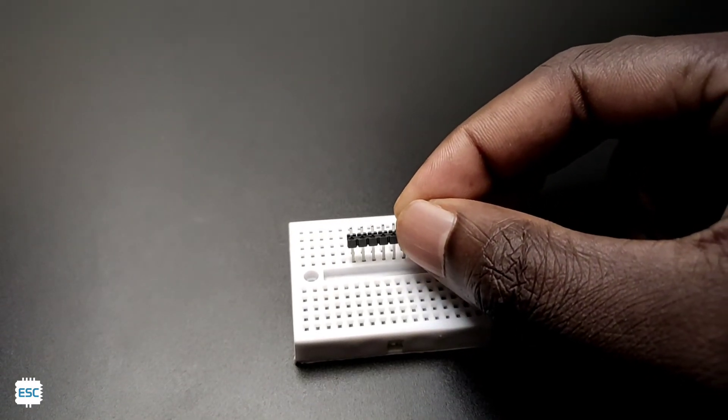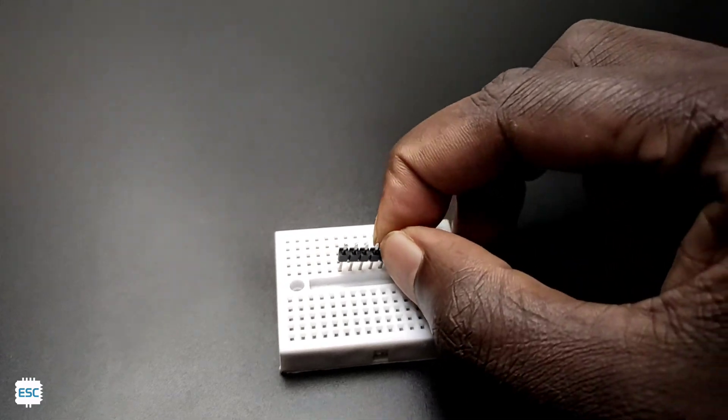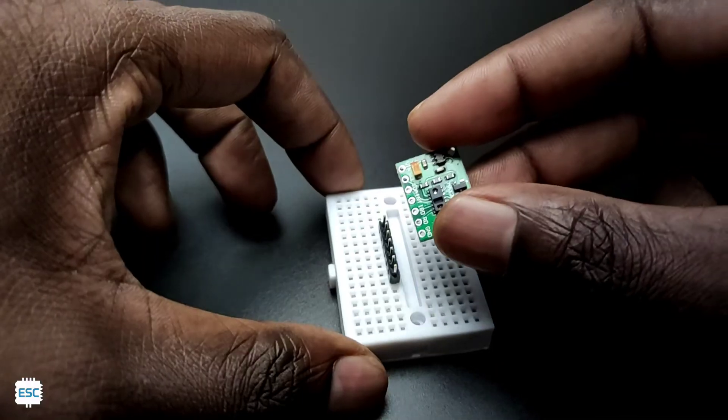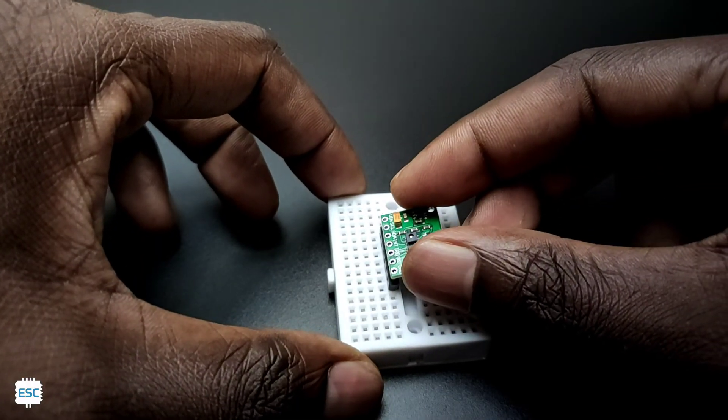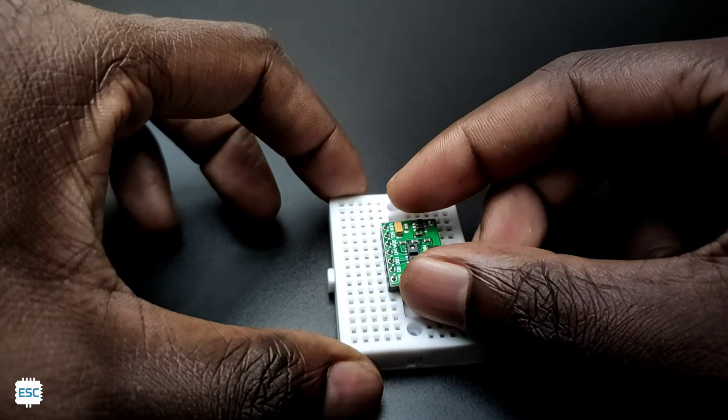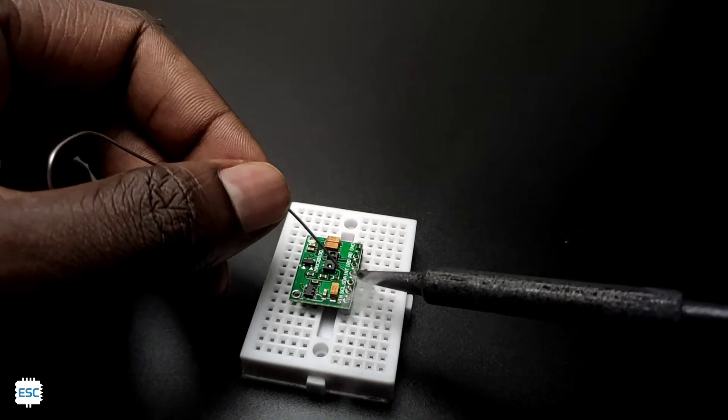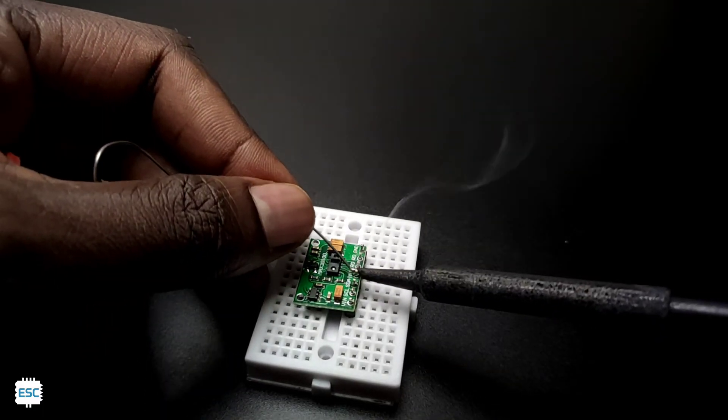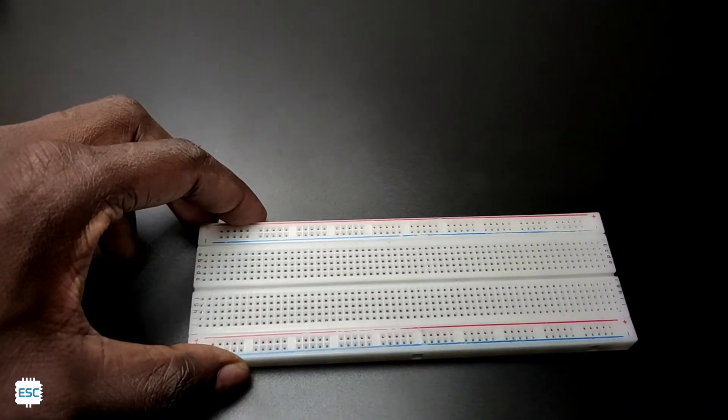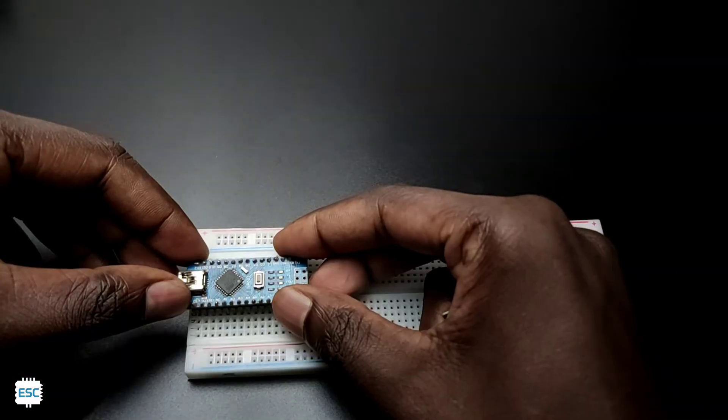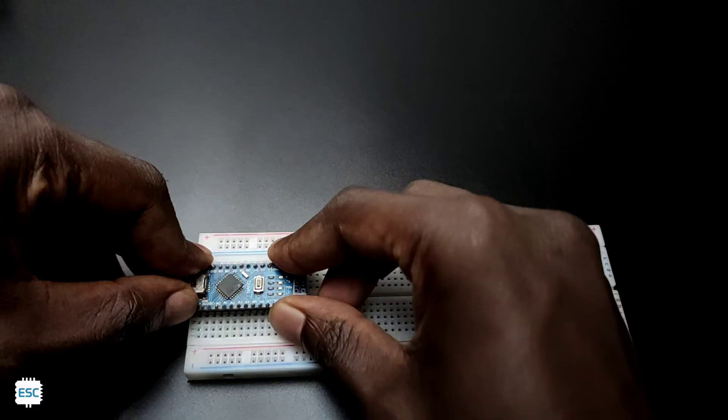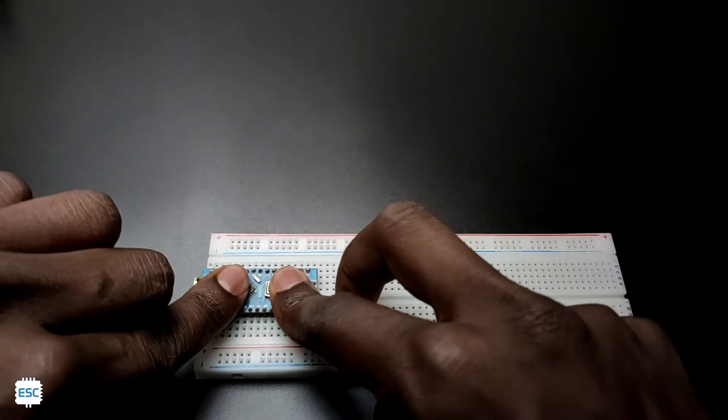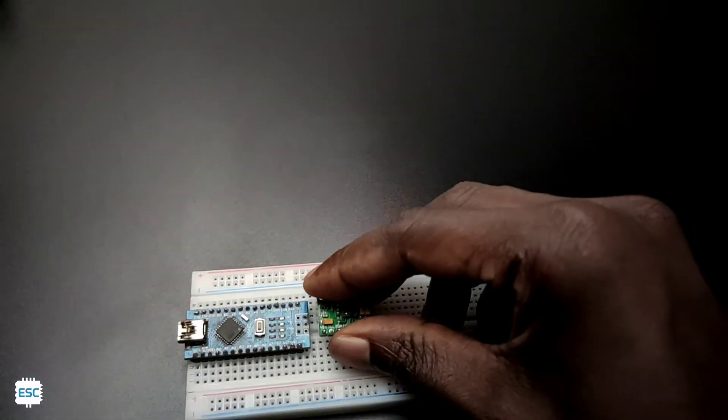To test this, I placed the male header pins on a small breadboard and placed the oximeter module on top of the header pins and soldered them. Now I placed Arduino Nano on the breadboard.